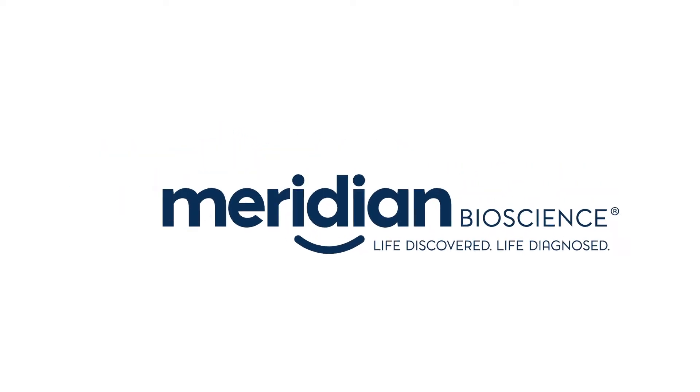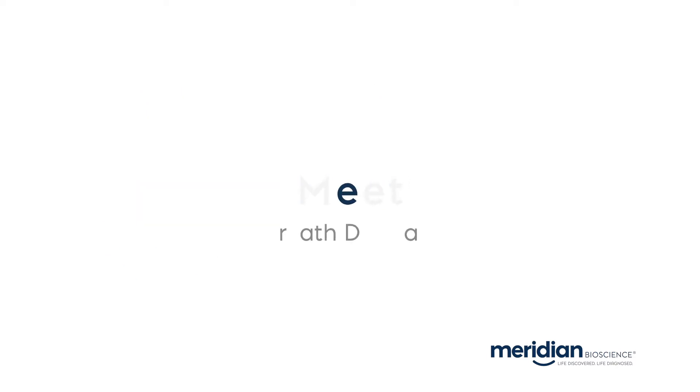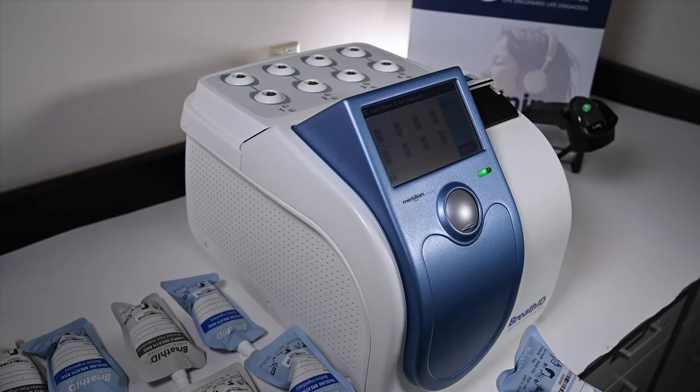Meridian Bioscience presents BreathID Smart for urea breath testing. BreathID Smart is a compact benchtop instrument with a simple three-step workflow.